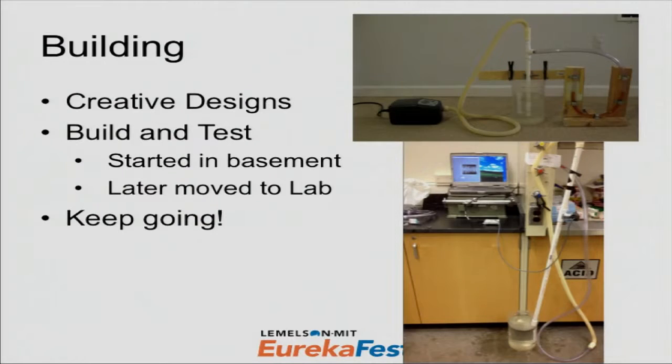And so we started off just on paper, thinking of all the different crazy ways we could possibly make something that might work. And I think one thing that's really important is when you're at the very beginning, you've got this problem that's well-defined. We need to solve this. We need to make a device that provides a high and a low pressure with the bubble CPAP setup. You think of all the different ways that you could do this, and you talk to other people, you get their ideas, but at this point, nothing's out. Any idea is valid.